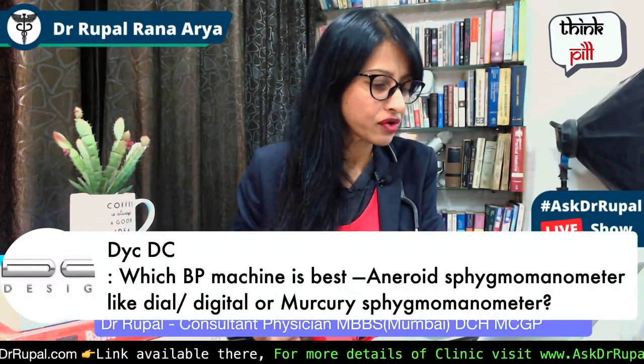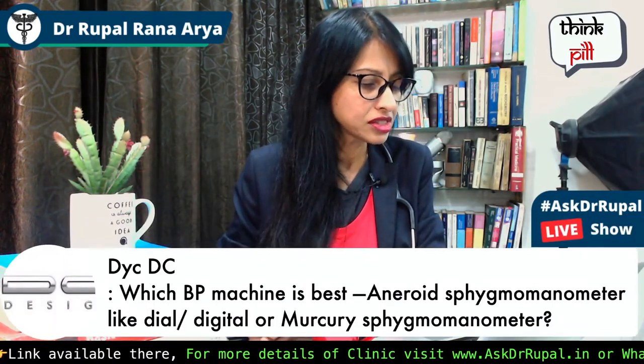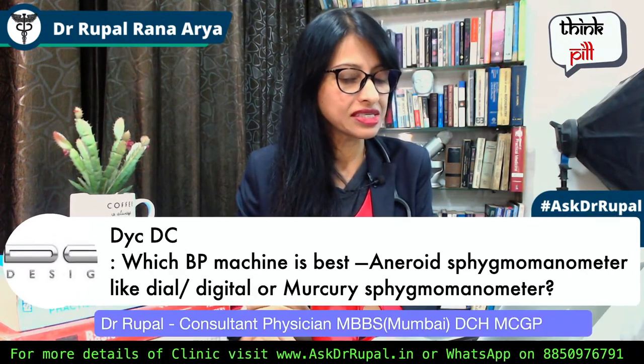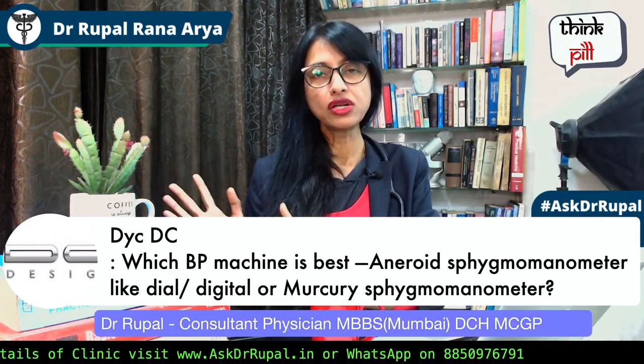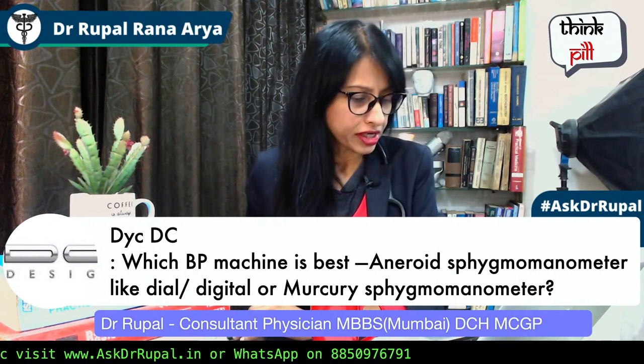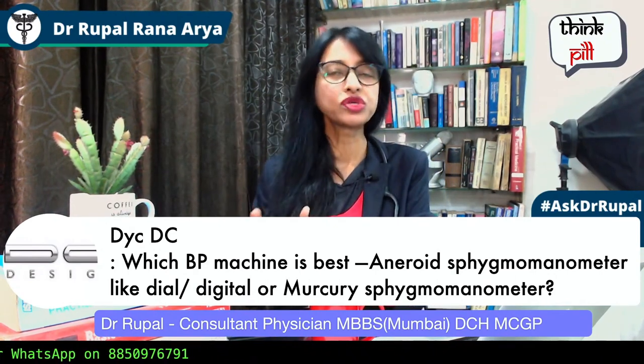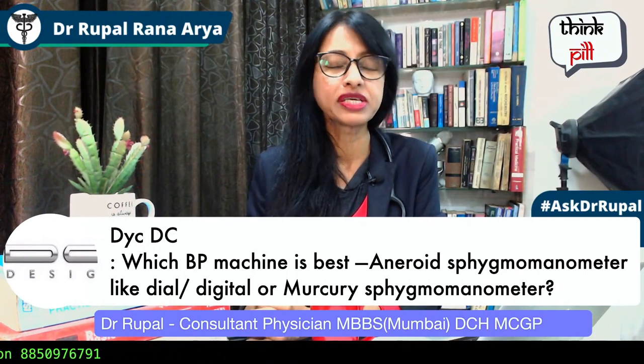Which BP machine is best? Aneroid Sphygmomanometer like dial, Digital and Mercury Sphygmomanometer. Very good question. Look, digital and manual blood pressure monitor — like you said, Sphygmomanometer, or BP measure instrument, we call Sphygmomanometer.